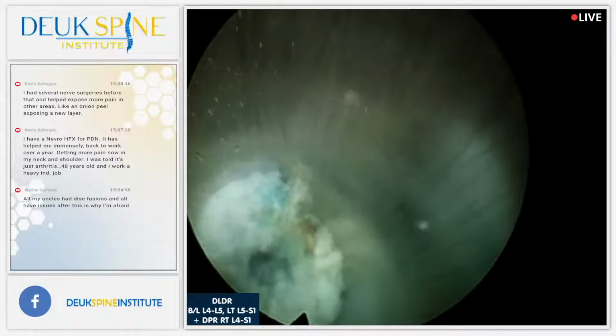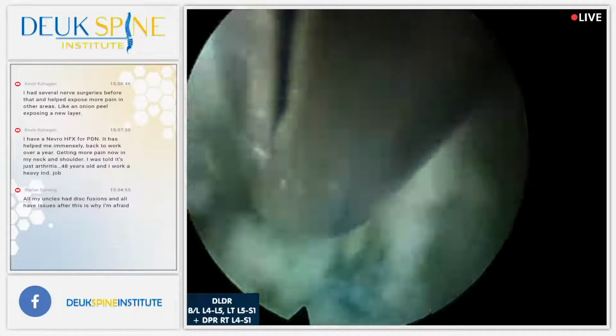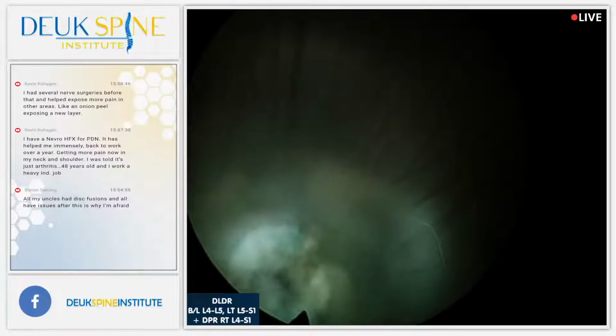Hey guys, how's the irrigation? Working on it? Okay, good. Yeah, we need it. It's okay, no problem, just take care of it.